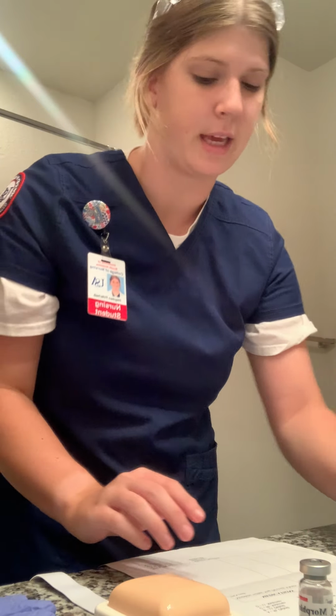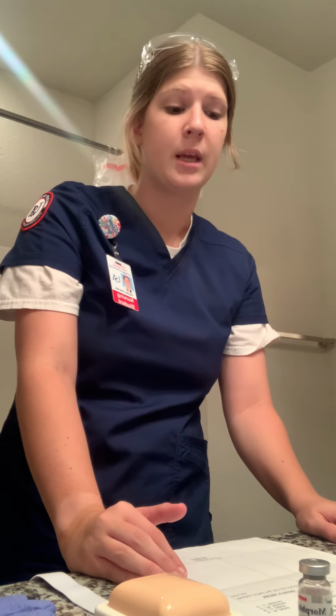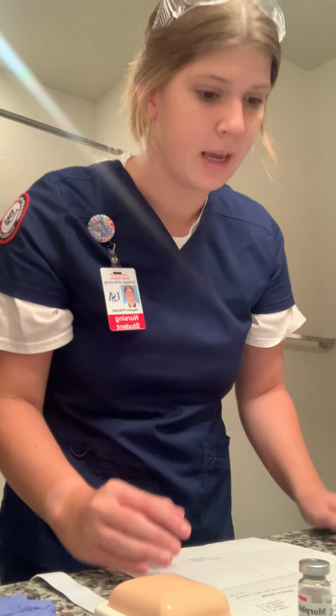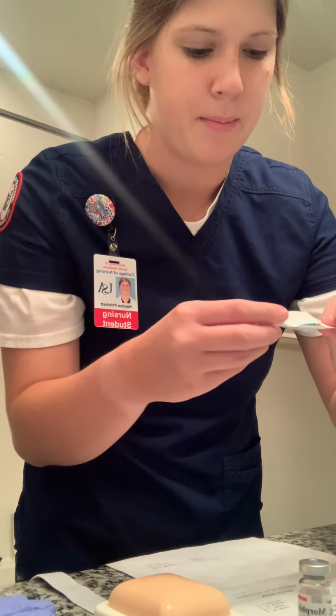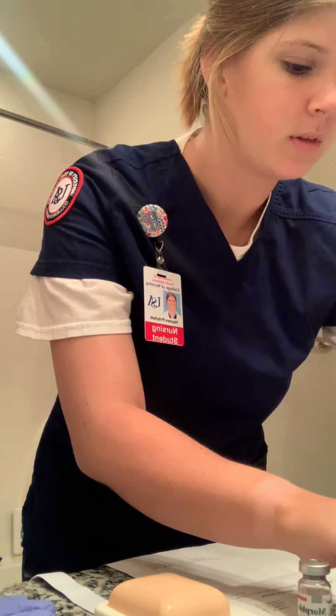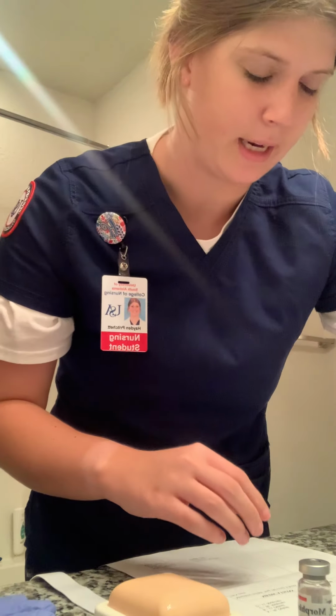So to calculate that dosage, since it is 10 milligrams per 1 milliliter, it will be a half milliliter shot for 5 milligrams. And also to go along with that intramuscular shot, I will be using my 23 gauge and 1 inch needle. And I'll also be using my blunt cannula to withdraw the medication.